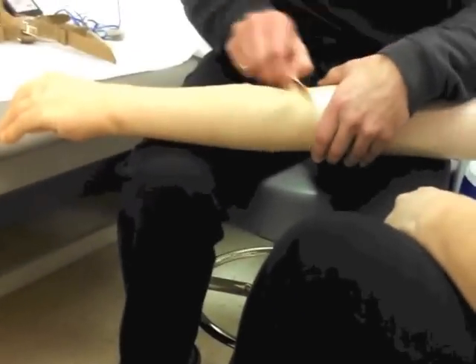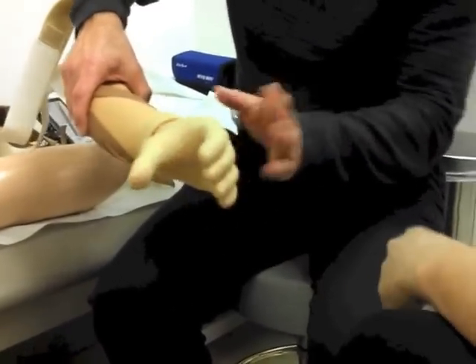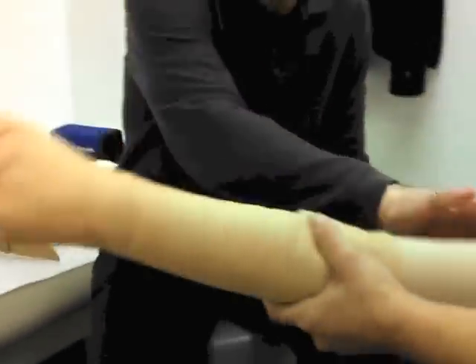But this is just a glove. They don't even make this glove anymore — this is a company that used to make these gloves. They're made of silicone, but they're generally made of vinyl or silicone. This is another type of vinyl that goes over top of it. There's an inner glove that goes inside this one too. This is maybe the lightest one. Even though this is a little heavier — this is a long socket — this is probably your lighter prosthesis, that you wouldn't be carrying around as much weight.